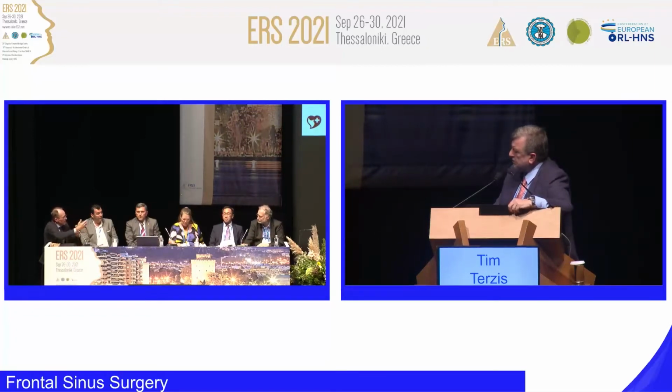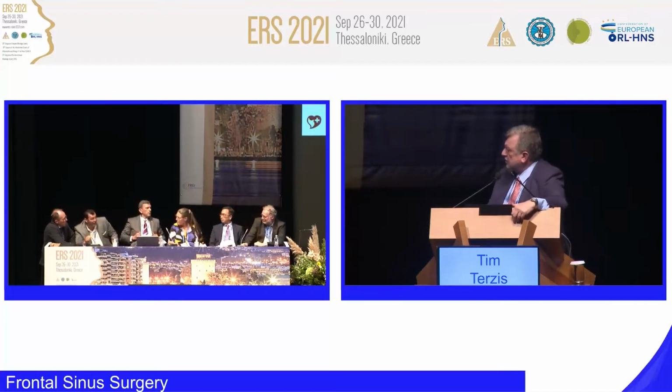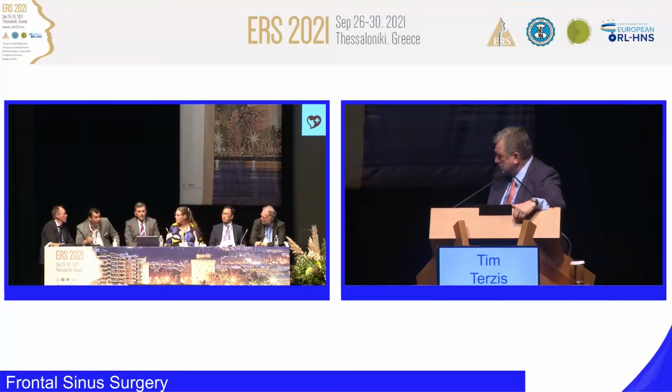But right. You are asking the... Yes, just a short comment. Oh, sorry, Philippe. Okay, just a short comment. In this kind of case I look not only at the mucosa, but also at the bone. If we have new osteogenesis, this will let me decide whether to make a 2B or a type 3.